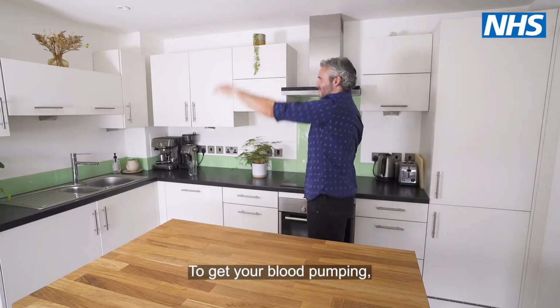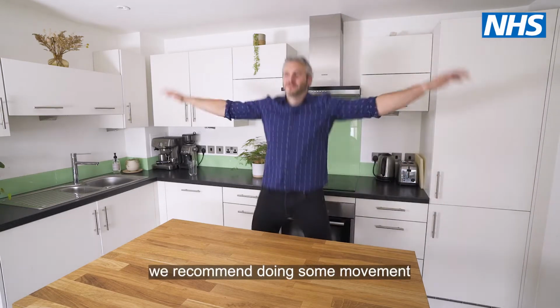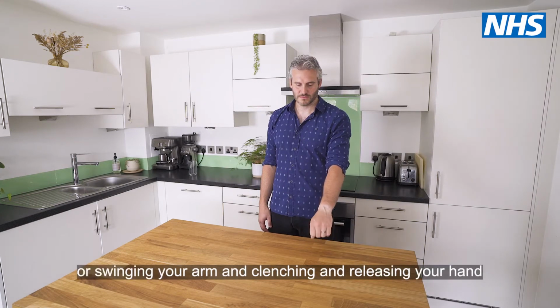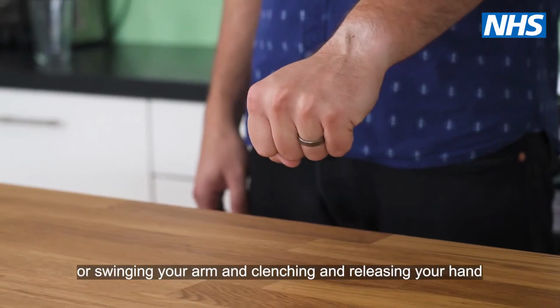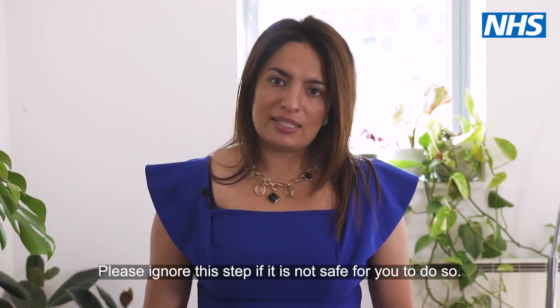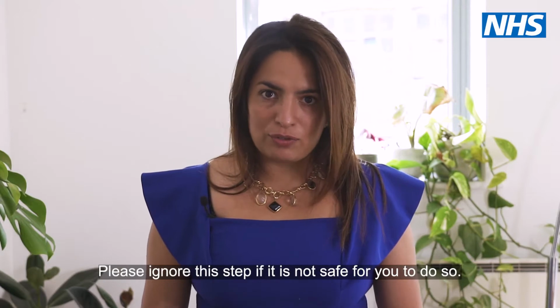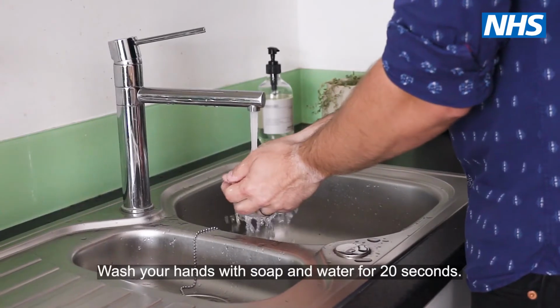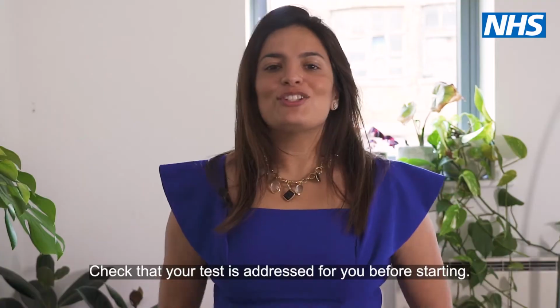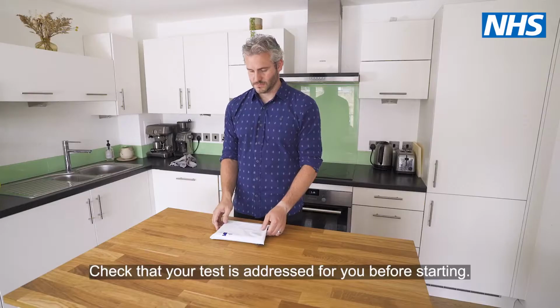To get your blood pumping, we recommend doing some movements like jumping jacks, skipping on the spot, or swinging your arms and clenching and releasing your hands, or whatever you feel able to do for a minute. Please ignore this step if you do not feel that it is safe for you to do so. Wash your hands with soap and water for 20 seconds. Check that your test is addressed for you before starting.